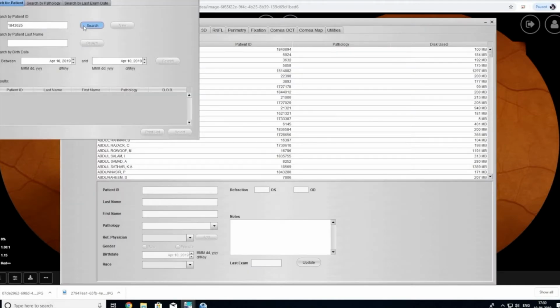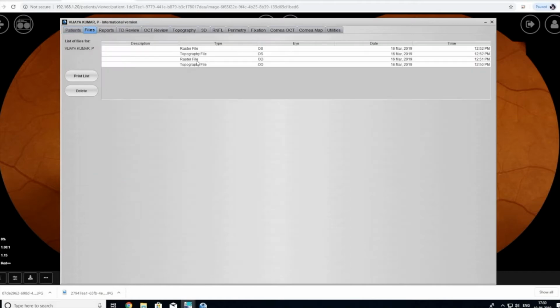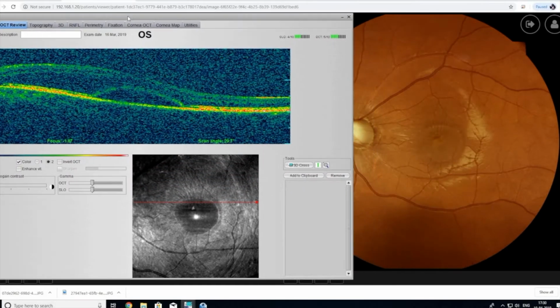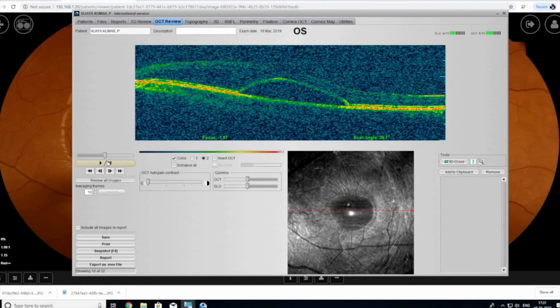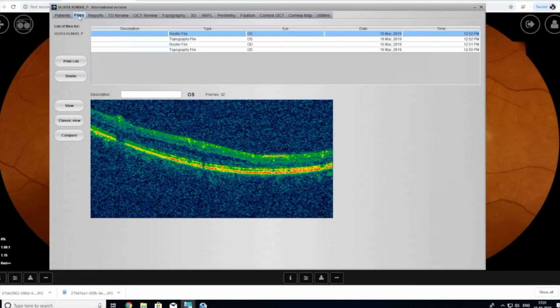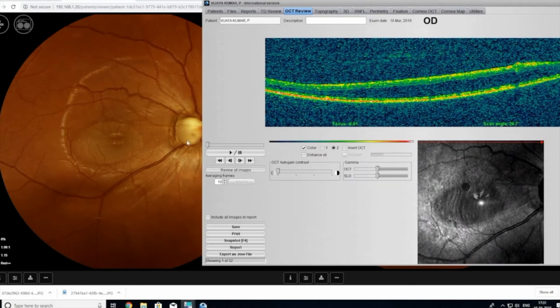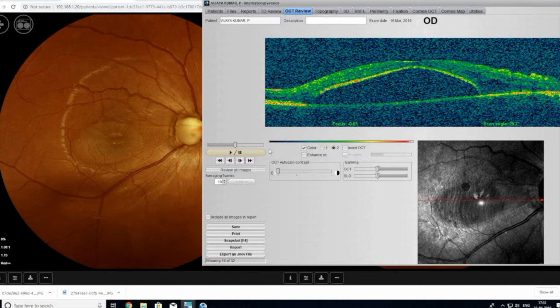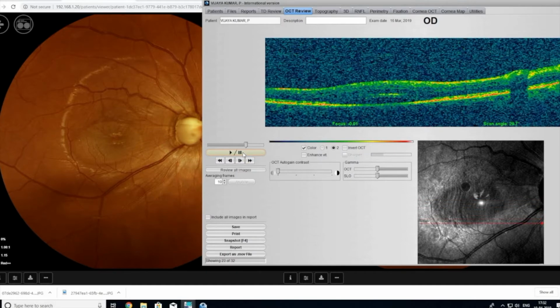When the OCT imaging is open, the cross-sectional image shows the collection of fluid under the retina, and a side-by-side comparison can be made with the fundus picture. Moving on to the right eye, the cross-sectional image on the OCT reveals an even greater amount of subretinal fluid accumulation than the left eye, suggesting immediate treatment.